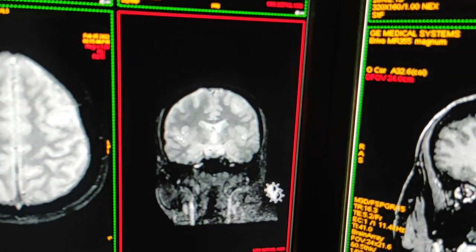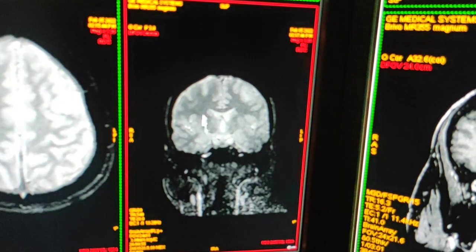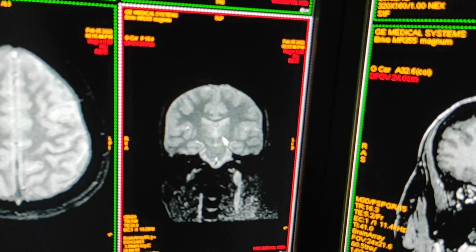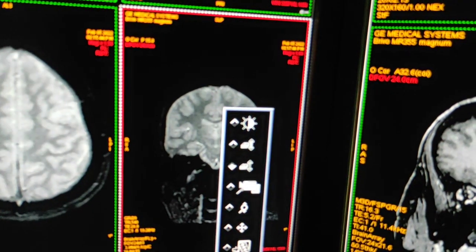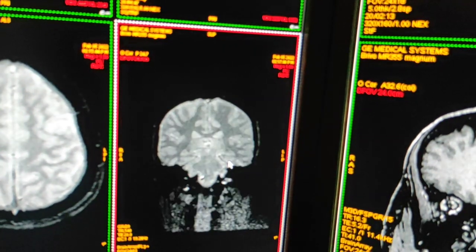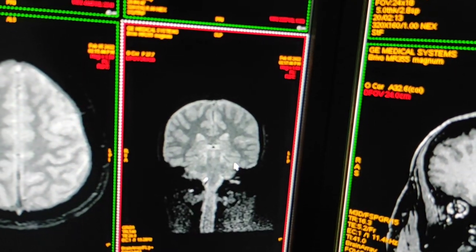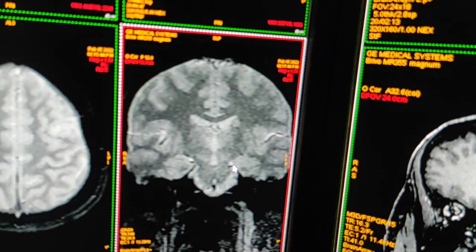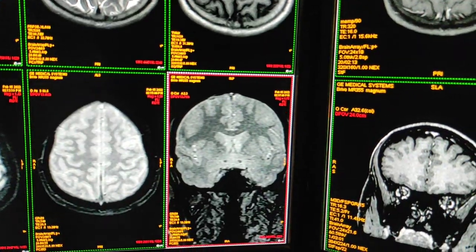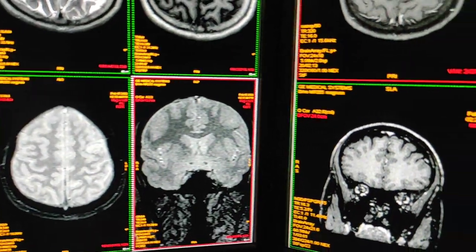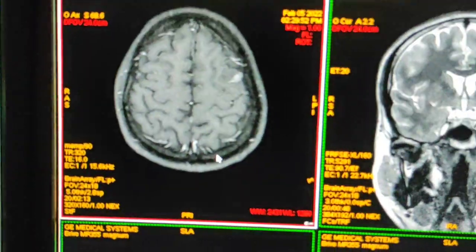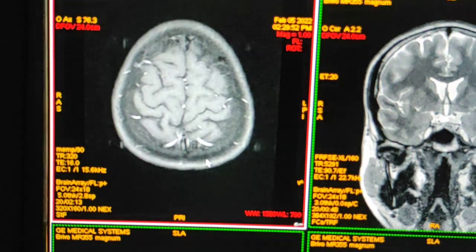Then I have taken thin GRE sections to rule out calcification. After that, we have given contrast. This is the axial post-contrast sequence.